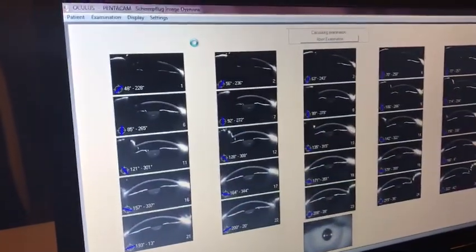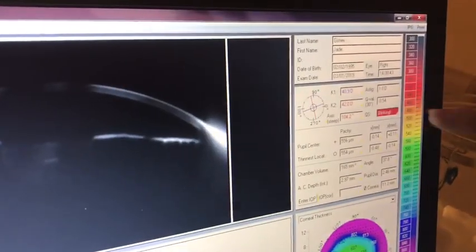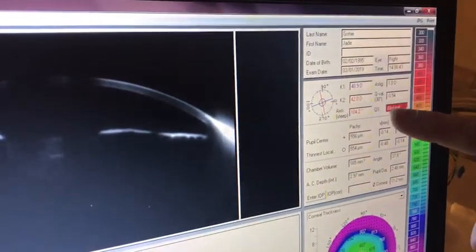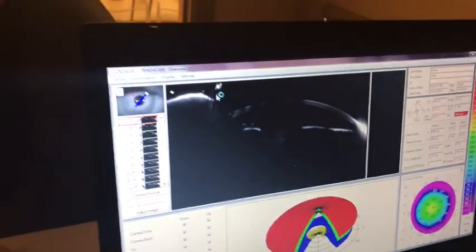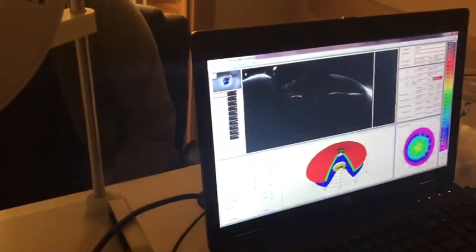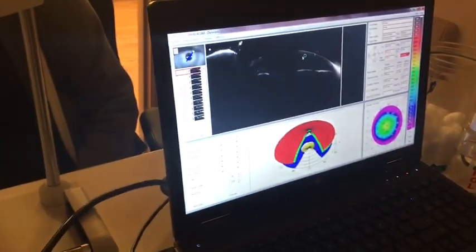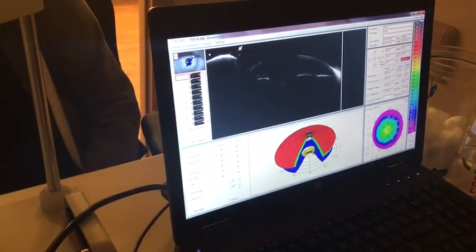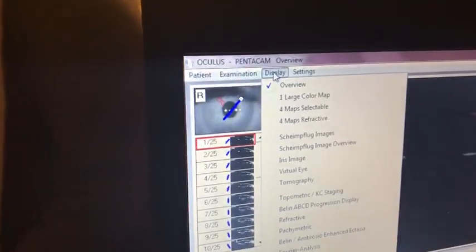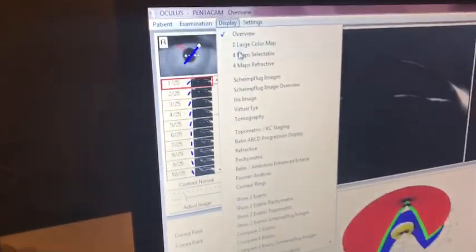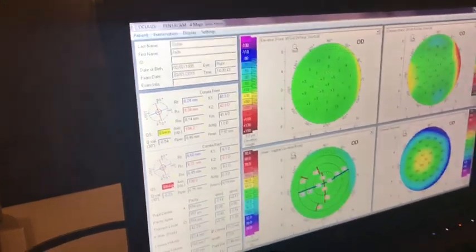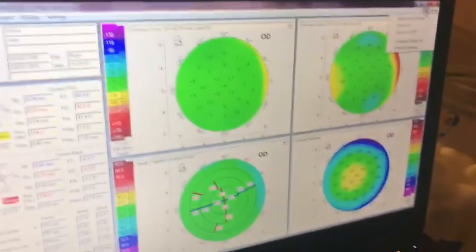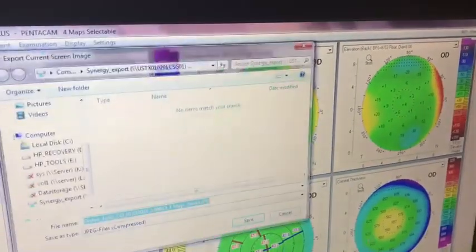And now we're going to look over here and whenever you know your picture's good it's going to give you an okay right here or it might say blinking. If it's a patient it says blinking, redo it until it says okay. It could also say data gaps or something else like that. But once you get a good picture you're going to go to display. And we send two different pictures on each eye. Four maps selectable first. And to send it you go to JPEG, export, and then save.